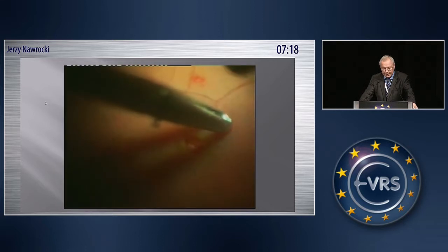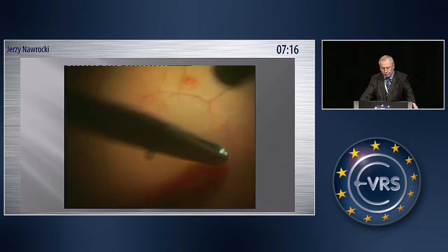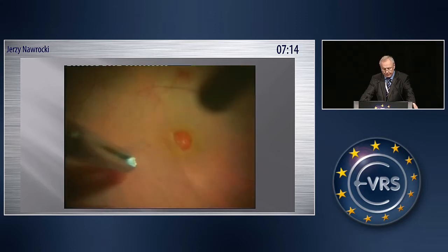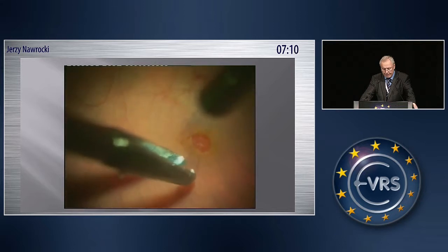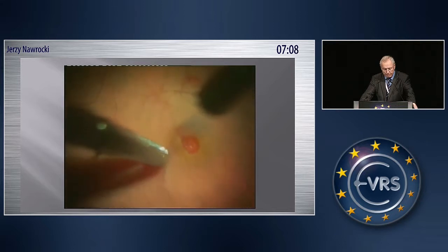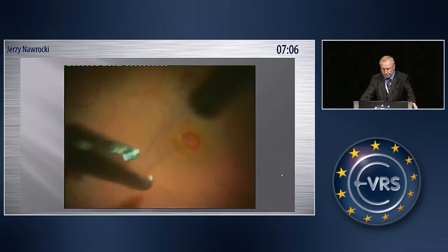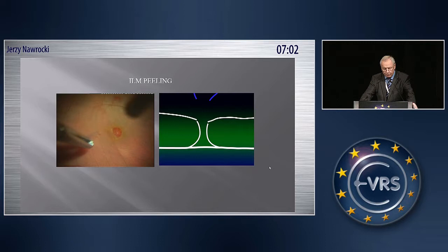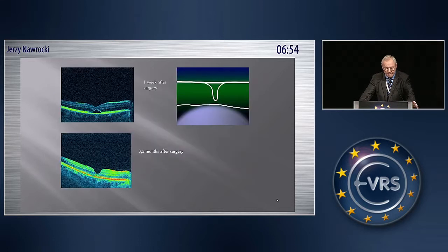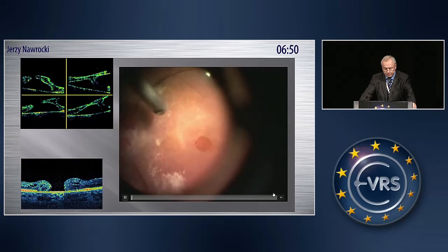Then we peel ILM all around the macular hole. It is also an older video, and everybody of you knows the technology. We peel ILM routinely around the macular hole in each case. I did it until 2005. What do we achieve? We induce some gliosis by trauma to the retinal tissue and give some surface, with gas injection, for the macular hole to close.